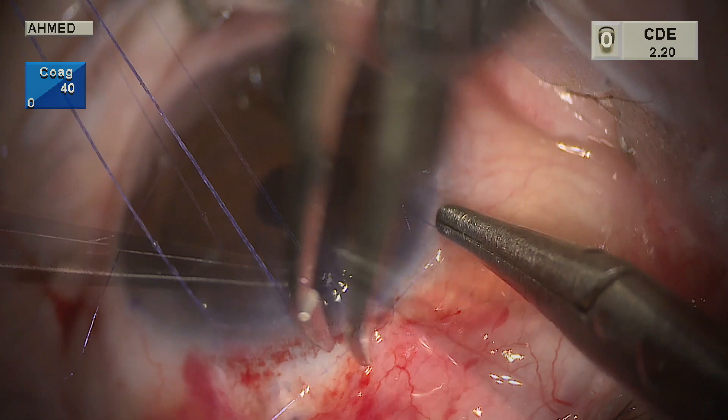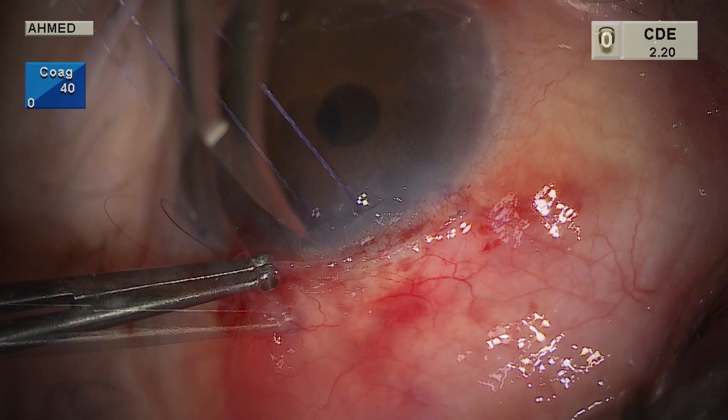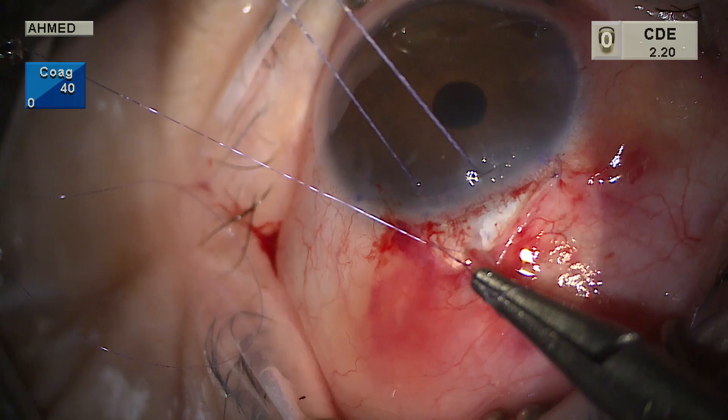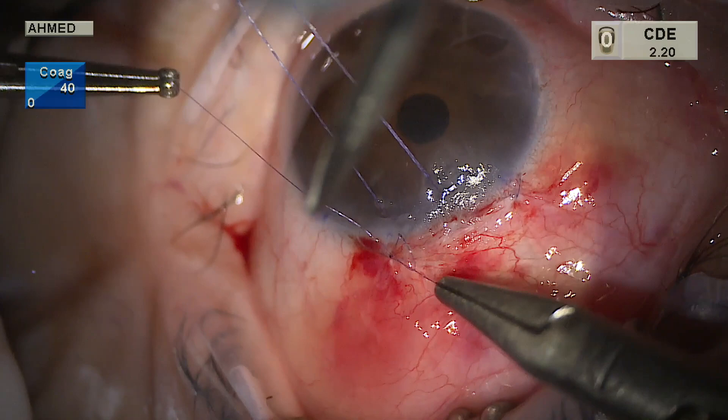Tenon's has been brought forward — this is an important step to ensure a nice posterior bleb under Tenon's diffusing posteriorly. The conjunctival-Tenon's flap closure is anchored to the episclera by the first throw, bringing conjunctiva forward. We want this flap to be under tension at the limbus, pulling the conjunctiva to create tension and facilitate a watertight closure. The initial throw is made in the episclera at the limbus, then through conjunctiva and Tenon's, creating wing sutures at either end.